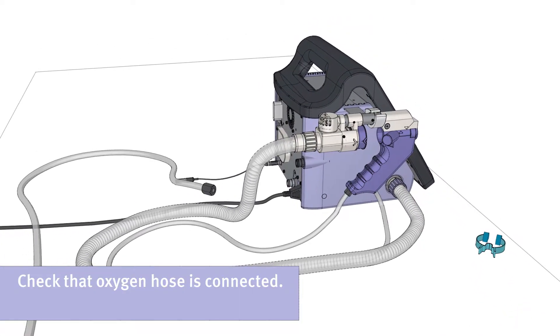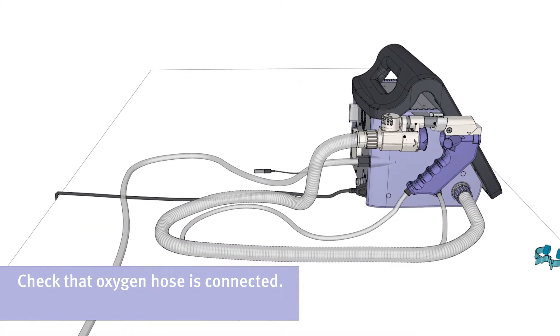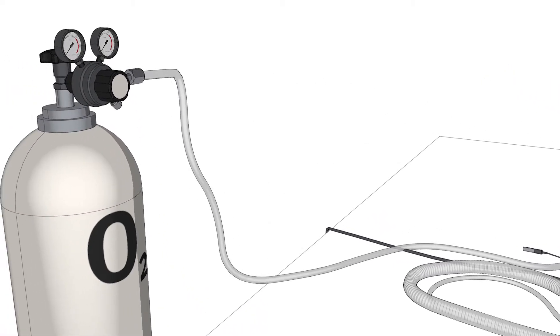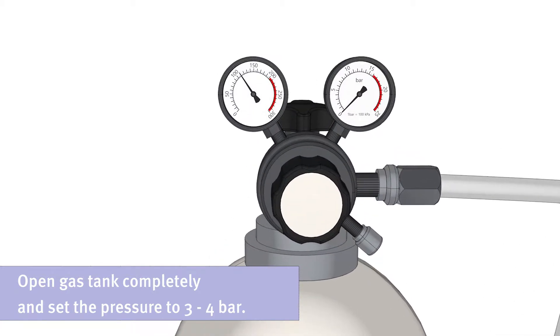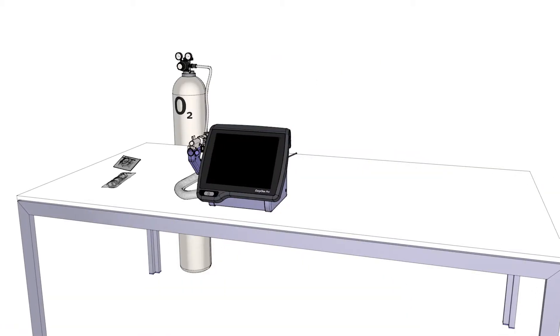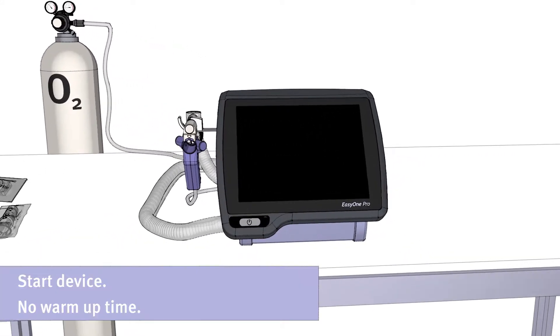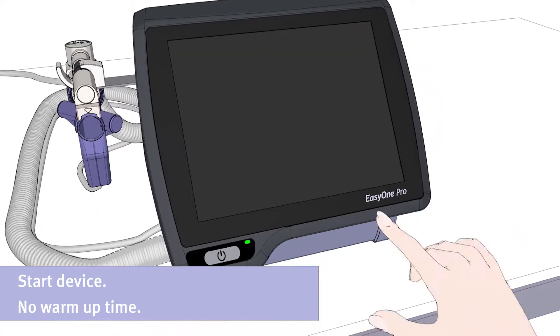Please start with checking that the oxygen hose is connected. Open the gas tank completely and set the pressure to 3 to 4 bar. Now start the device by pushing the on-off button. You do not need to consider any warm-up time.